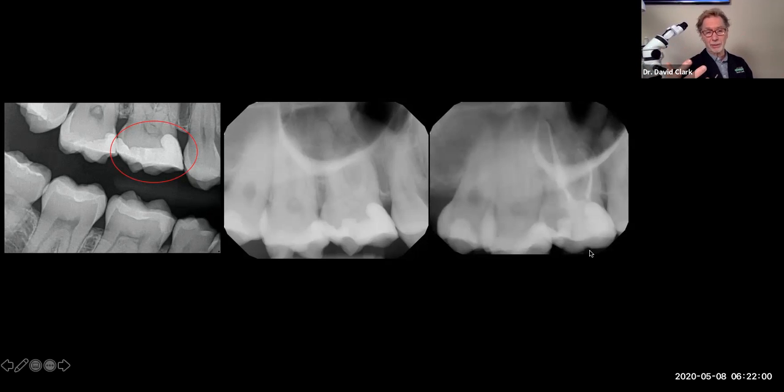And you know what was interesting with Tatiana? After I did the endodontic therapy, and you can see with the endo that I went right through the composite into the mesial buccal. That is just strangling the tooth. Look at where the access for the endo was and look at where that composite was. It's just the wrong treatment.